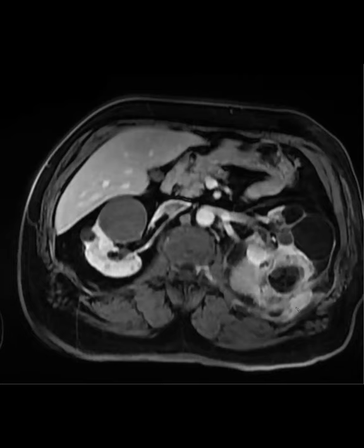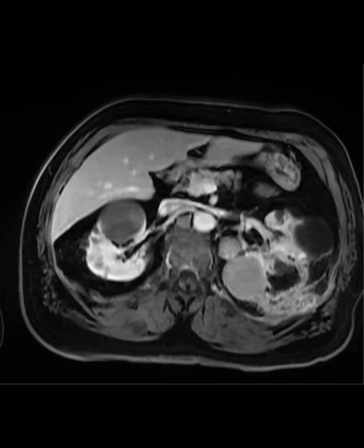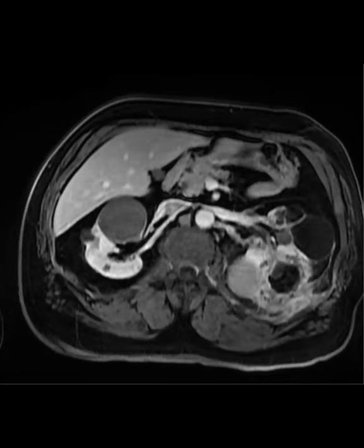So what do you guys think? I don't like the tissue growth, but it's kind of fast for a recurrent tumor. Yeah, it's kind of fast and kind of weird, right? Why is the tumor only growing along the edge? Often, say you do an ablation and you miss the medial aspect or a nodule, it'll grow like a ball, like a normal RCC. But this was growing all along the edge of the ablation cavity and then also into the wall here.